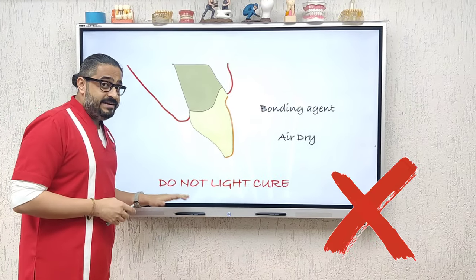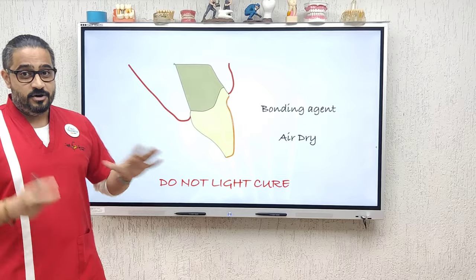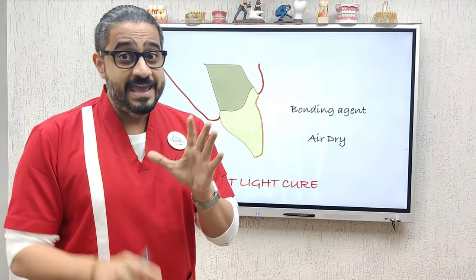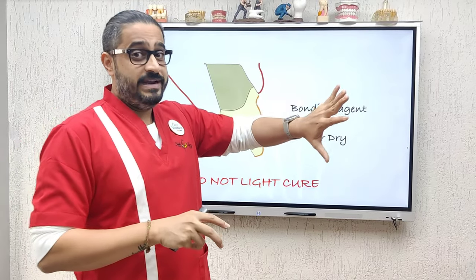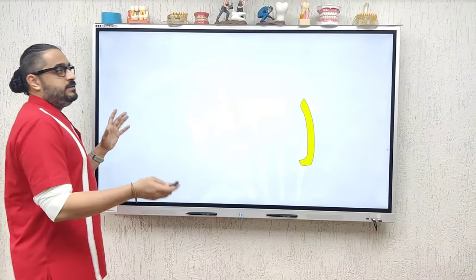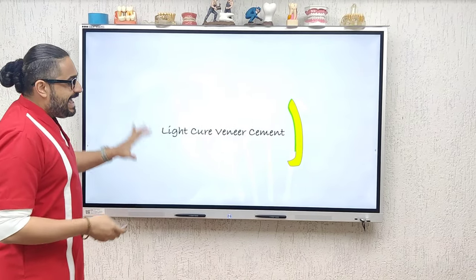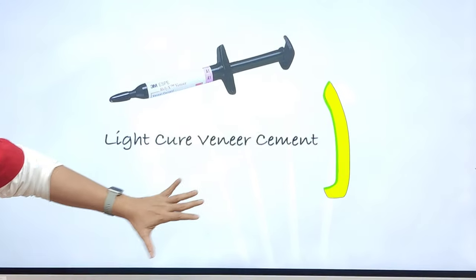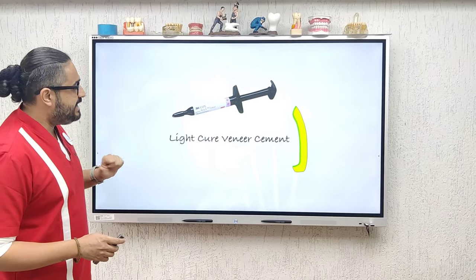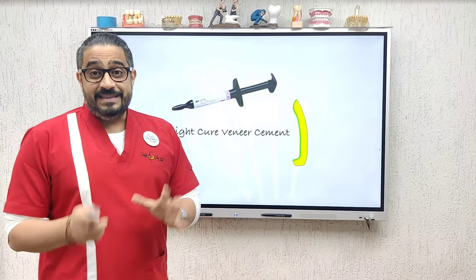Very important: please do not light cure this bonding agent. If you light cure it, there is a possibility your veneer may not seat completely. That is why even your chair light should not be focused on the prepared tooth. Now go ahead and take your light cure veneer cement. There are lots of them available in the market. The one I prefer comes from 3M — it is Rely X veneer cement. These are light cure only; please do not use dual cure cements.